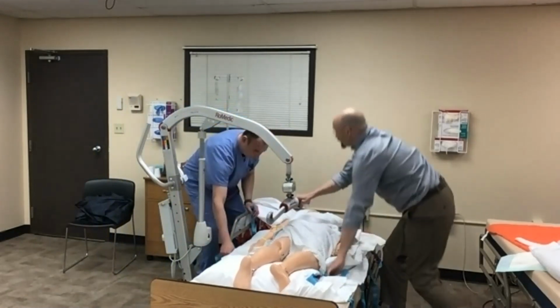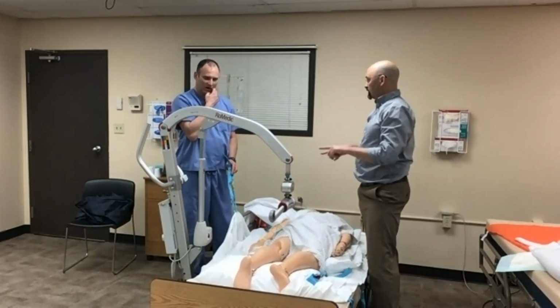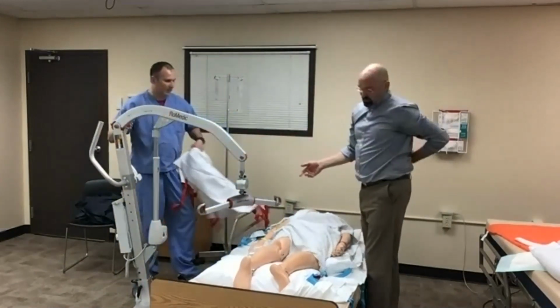So do you know what we ended up doing last time? I apologize. We actually put a slide sheet under and used it as we turn. Okay. So we're going to show you another way to do this. And I remember the reasoning for this now.